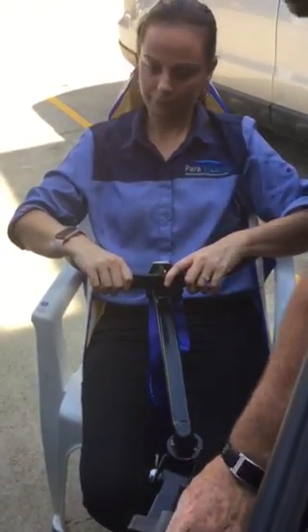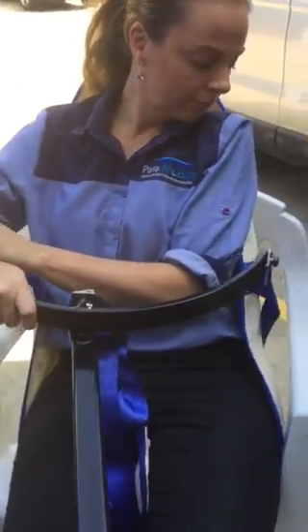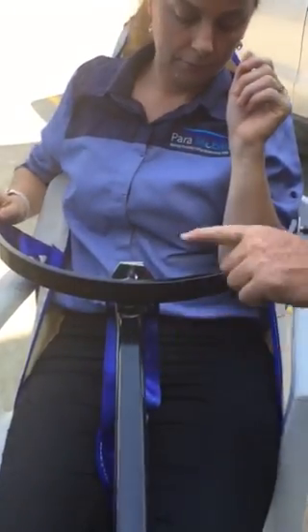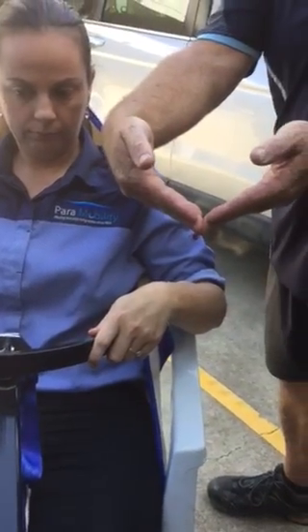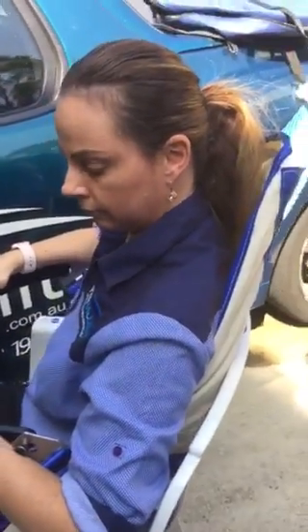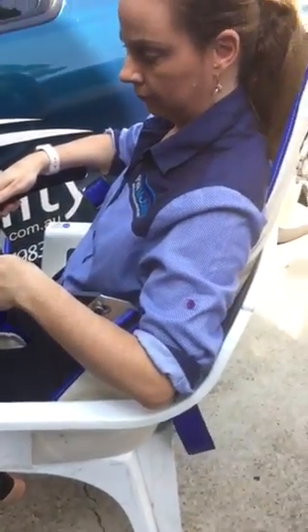The things that are important are really to make sure that the straps are at the right height on both sides, and then working out the length of the straps between the legs to make sure that we stay in a nice 90-degree position — not leaning back too far. This has got one of the high-back slings which has a bone in the back, so that's going to give some back support. Really work hard on getting those straps to the correct position to get that chest bar at the right height.